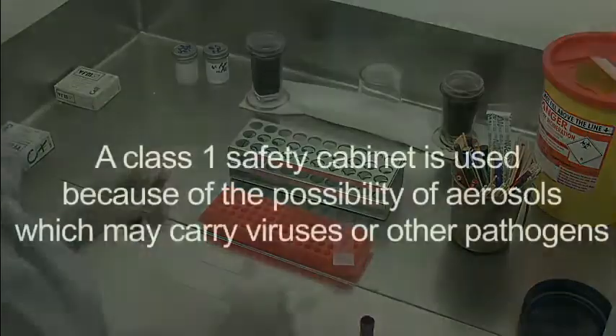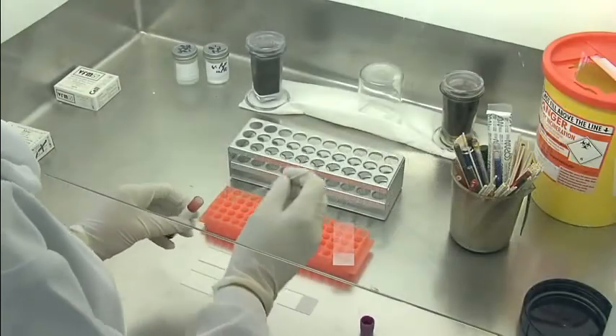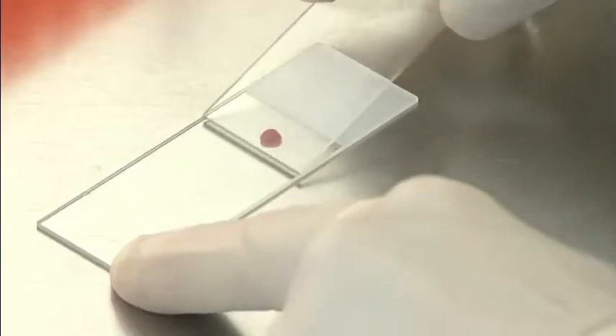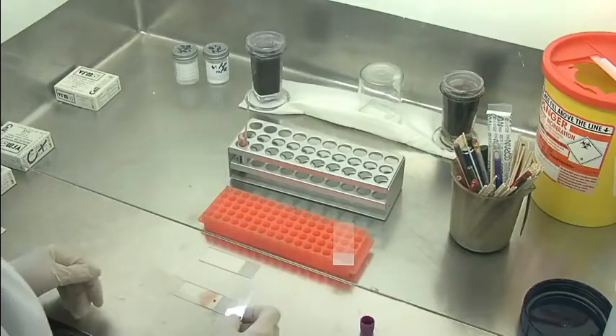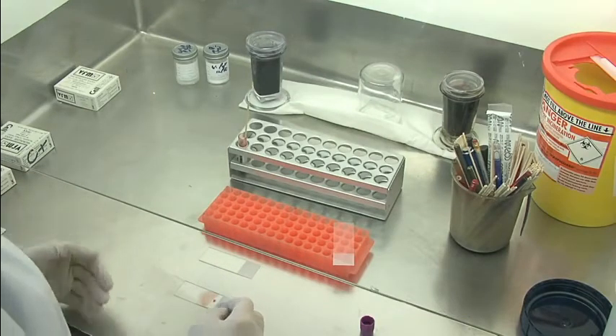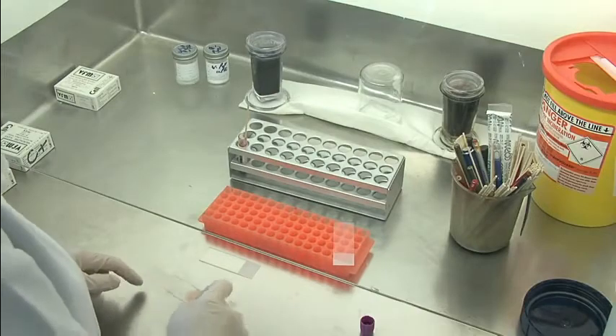Open carefully. We're performing this in the Class 1 cabinet because of course there may be viruses or other parasites, so everything is performed in the Class 1 cabinet. Take a drop of blood, put it on the slide, and then we're going to make a thin film. The reason for using a thin film is because you get a one-layer-thick preparation, and then it's easier to fix the film, and then you can look at the parasites, and the shape and size of the red cell.